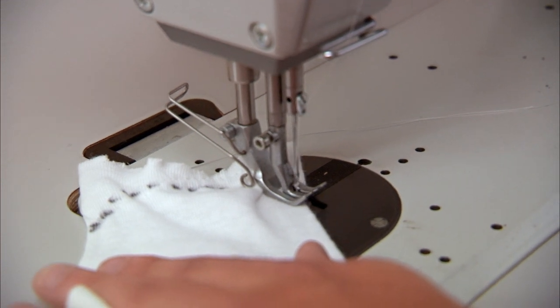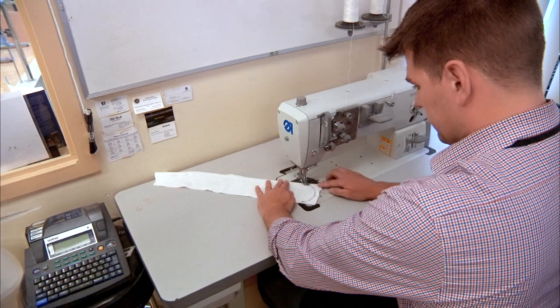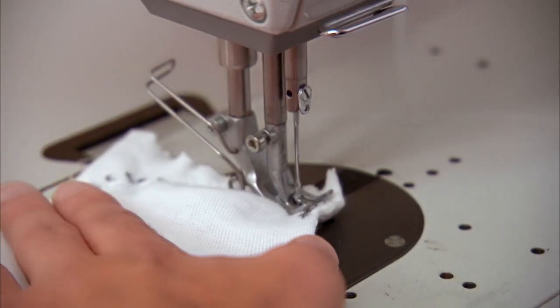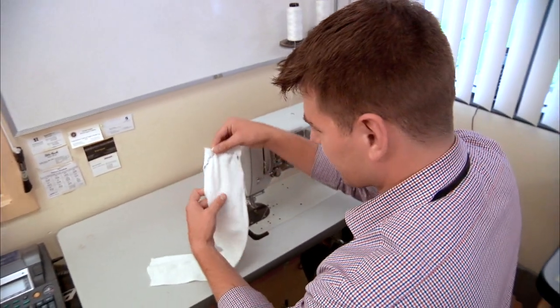Lock it in. Reverse. Right now. And take a few stitches. And the string pulled out. So, as you can see, mine doesn't look nearly as good as Brian's.